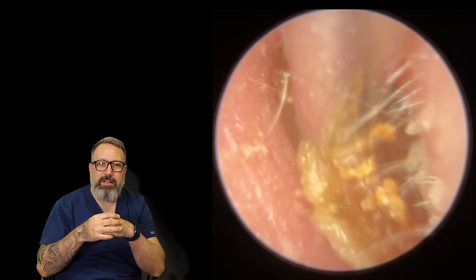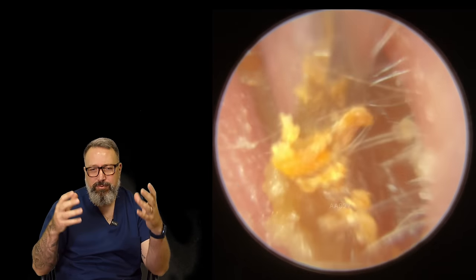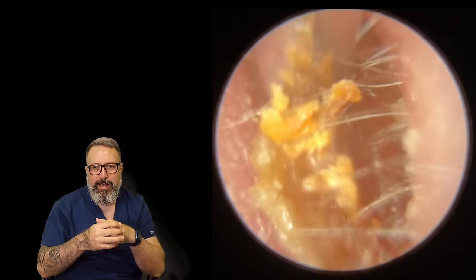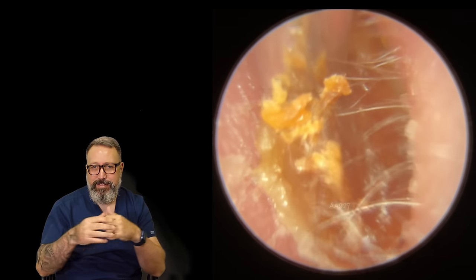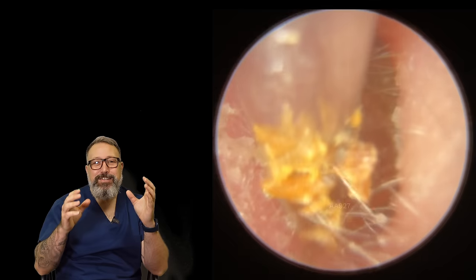Just going to give this a little bit more of a wiggle. Just so you know, guys, he's full up with a cold - that's what's going on. He's really croaky, coughing and spluttering. He did come into work today and we've sent him back home again. He's not good because he can't talk very well.